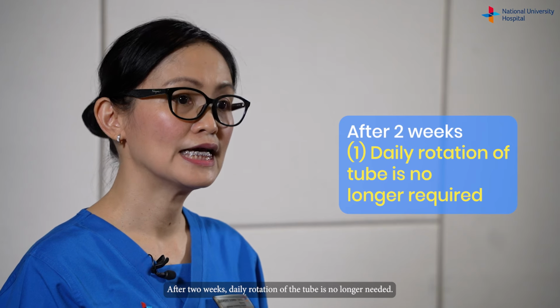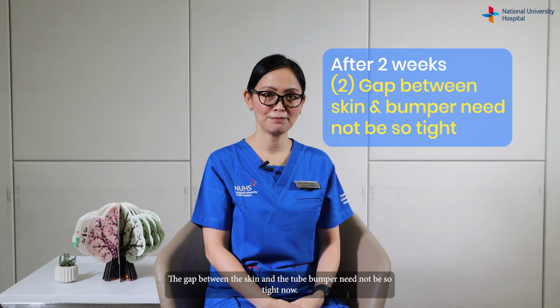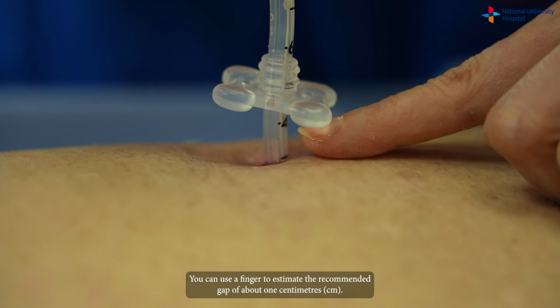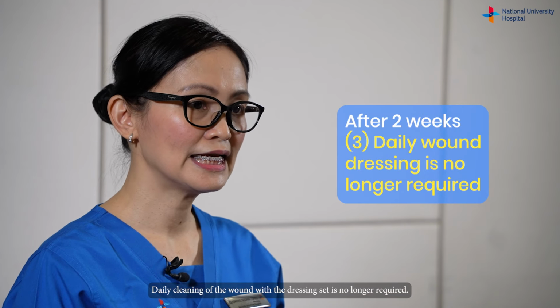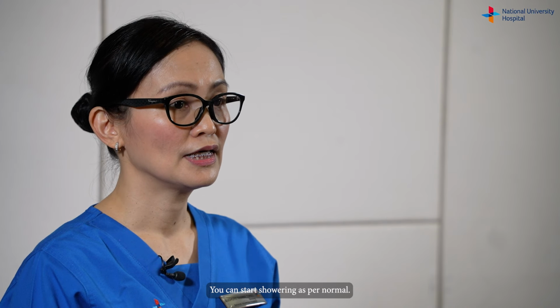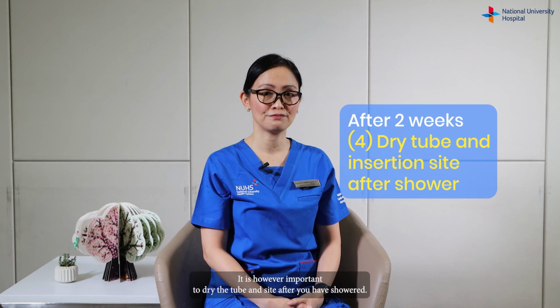After 2 weeks, daily rotation of the tube is no longer needed. The gap between the skin and the tube bumper need not be so tight now. You can use a finger to estimate the recommended gap of about 1 cm. Daily cleaning of the wound with a dressing set is no longer required. You can start showering as per normal. It is, however, important to dry the tube and site after having showered.